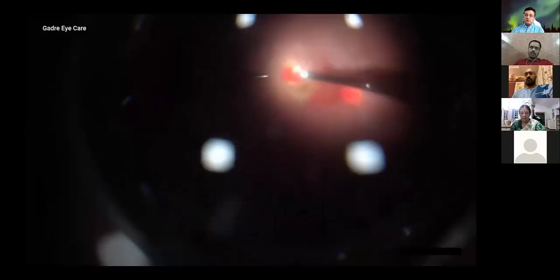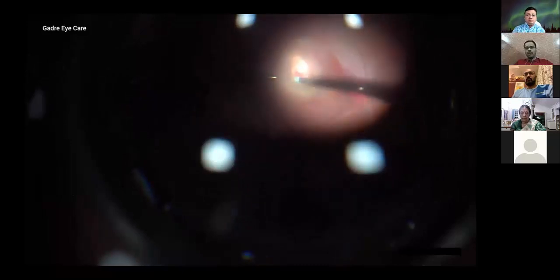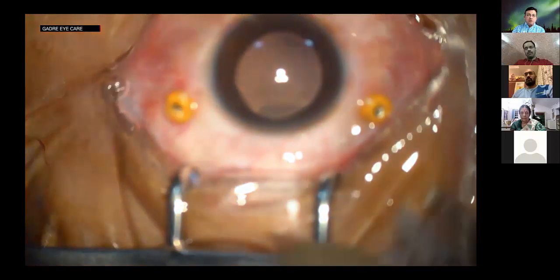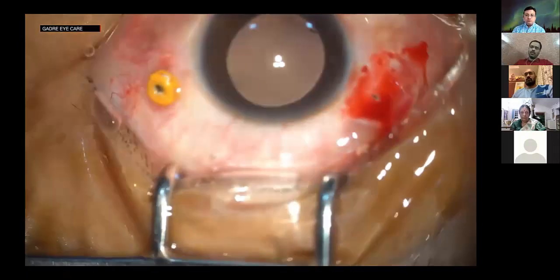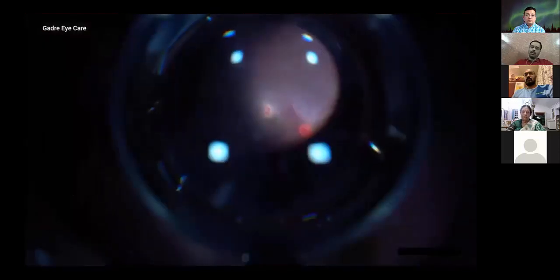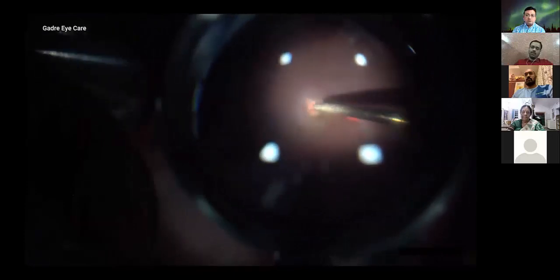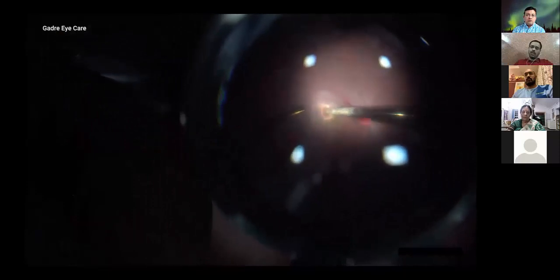Even after clearing this vitreous heme, one sees just a few exudates that are located at the fovea and near it. I tried to see if there is anything below it so as to remove. There was nothing that came. This superonasal sclerotomy, I enlarged it to 20 gauge, trying to just put a magnet and see if some foreign body which is there localized on CT and on B scan, but nothing was coming up.